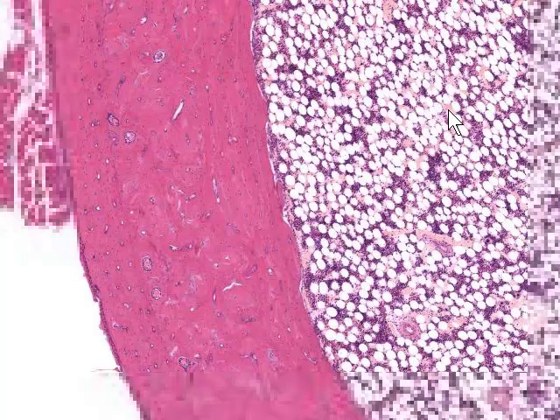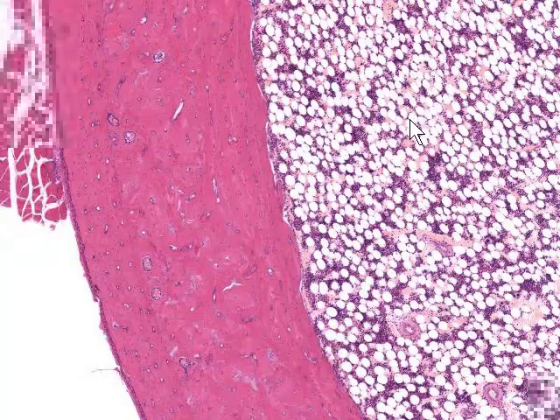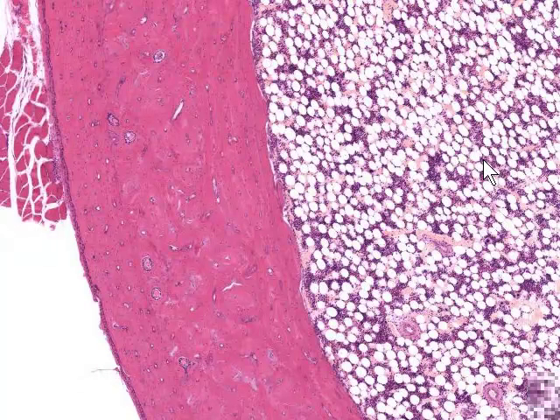So here, developing on this side, we have the bone marrow, and on this side here we have the bone itself. One thing that you can see immediately in the bone marrow are these large open spaces, and this is where adipocytes would have been found. And then the darker staining material you see here are blood stem cells, and indeed you'll see blood vessels, some of these you can see here, that course up and down through the marrow cavity. Please remember that bone is a highly vascular tissue, both the bony substance itself and also the marrow cavity. And here we're going to look at osteonic or lamellar bone as it appears in decalcified stained sections.